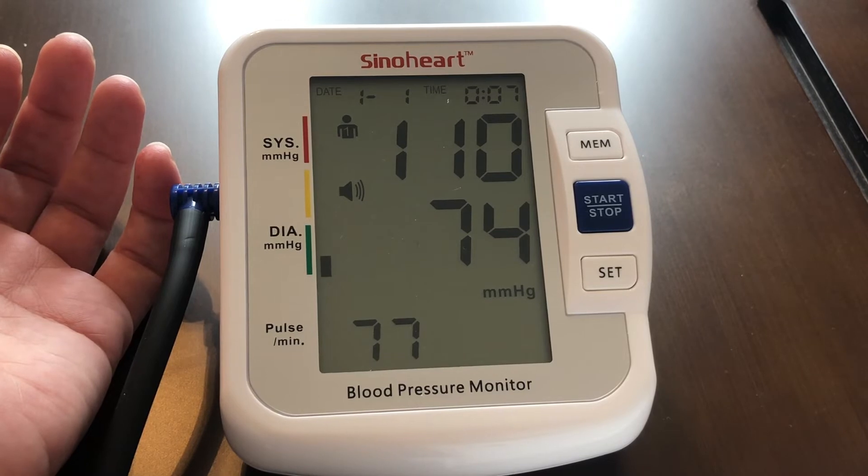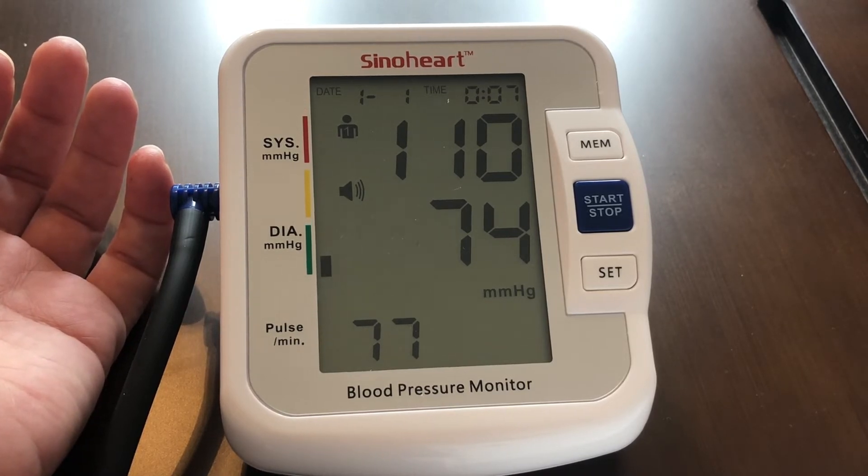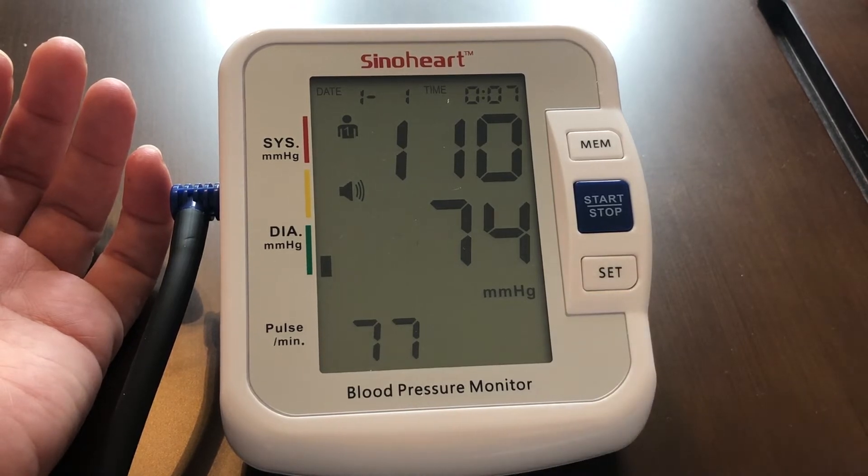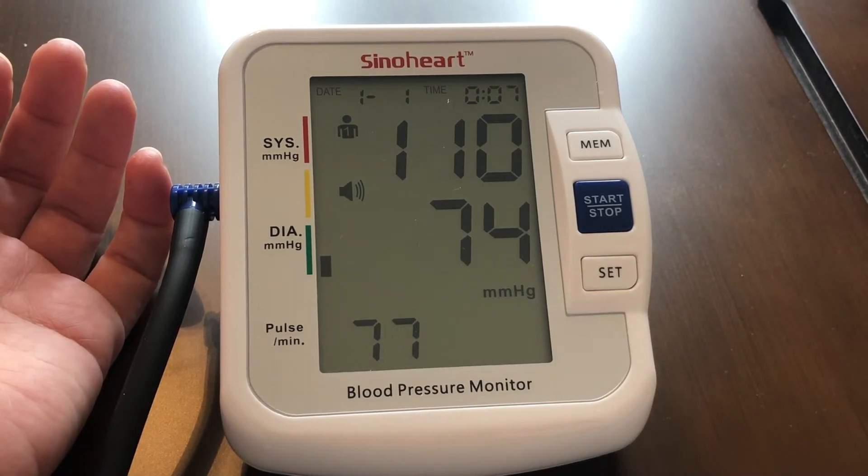Your systolic pressure was 110 millimeters of mercury. Diastolic pressure was 74 millimeters of mercury. Pulse was 77 beats per minute.